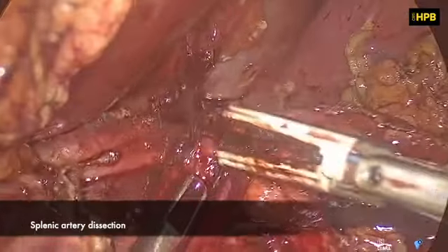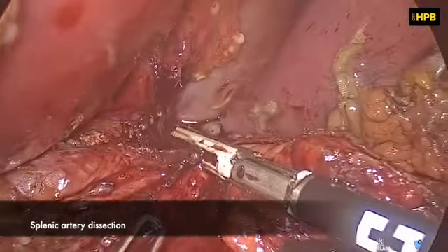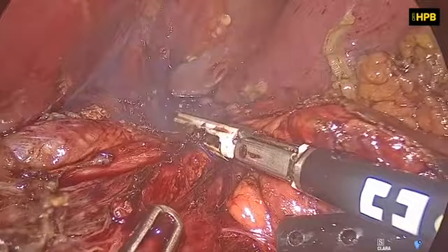Then, the splenic artery was identified and referenced with a vessel loop.